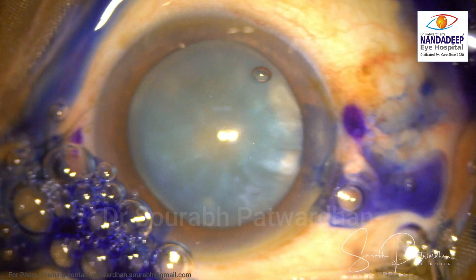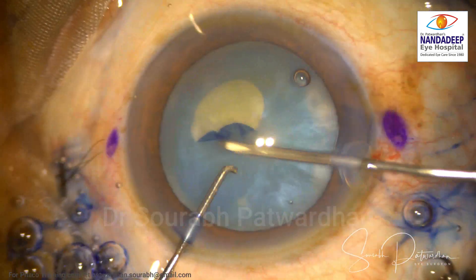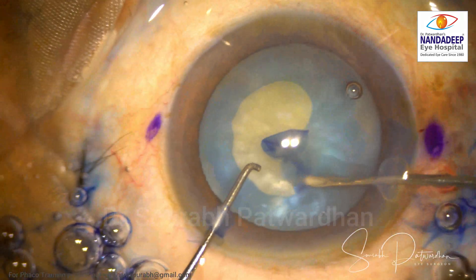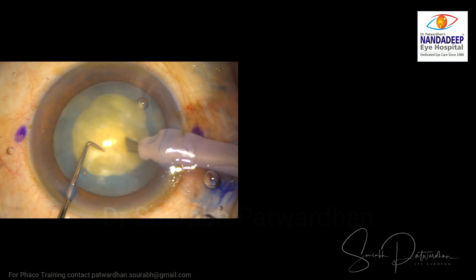I am going to use heavy dispersive OVD in this case — Hyalucote, which is a combination of 3% hyaluronate and 4% chondroitin sulfate. I made a CCC with cystitome, all going well, and I'm going to start phaco emulsification.